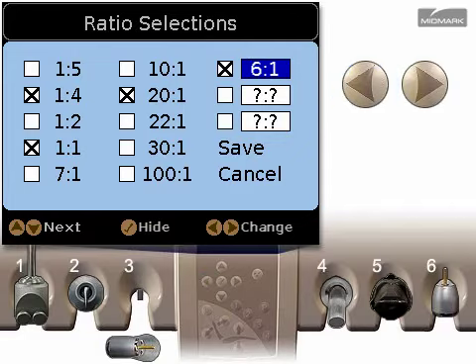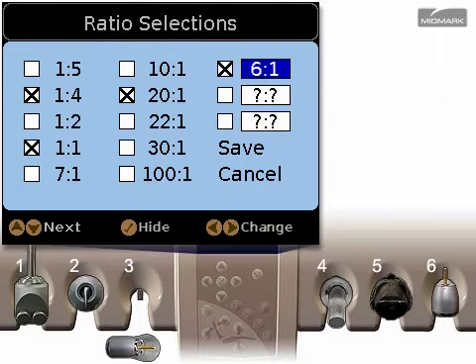128 to 1 is the maximum reduction. 1 to 3 is the maximum increase allowable as a custom setting.